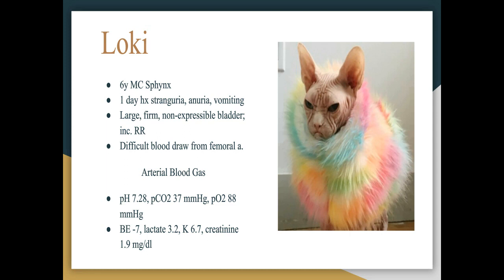My suspicion is the hyperlactatemia is probably due to the difficulty of the blood draw. Your creatinine should go up before your potassium in a patient with a post-renal azotemia. And therefore, this more significant increase in potassium than creatinine is suspicious. I would worry that there could be hemolysis of the sample due to the difficult blood draw, and I would recommend spinning a sample down to see if there is evidence of hemolysis when examining the plasma.